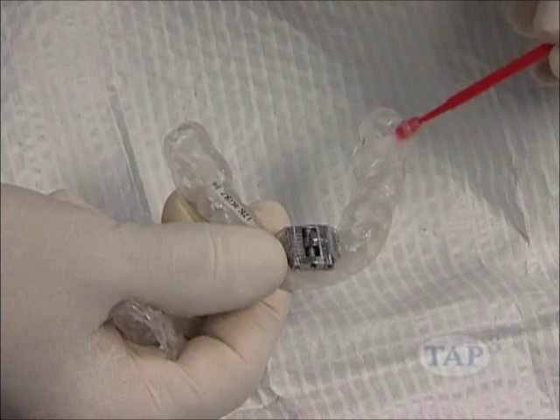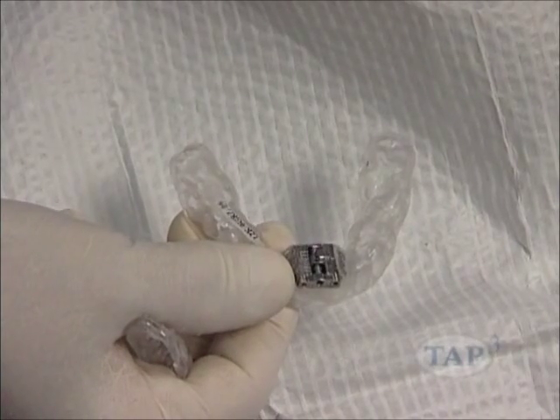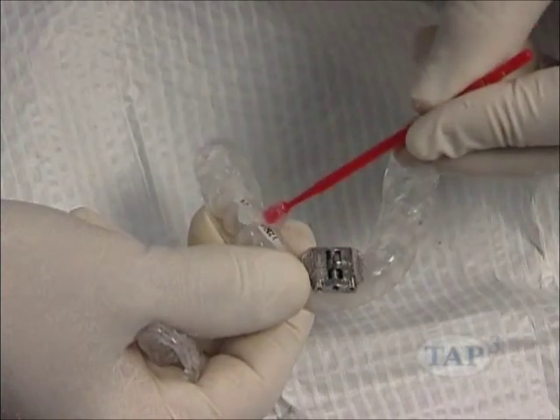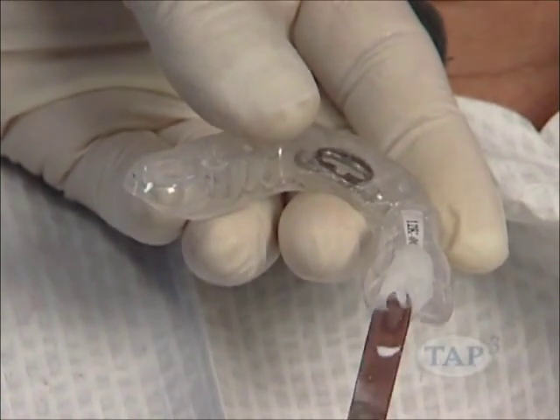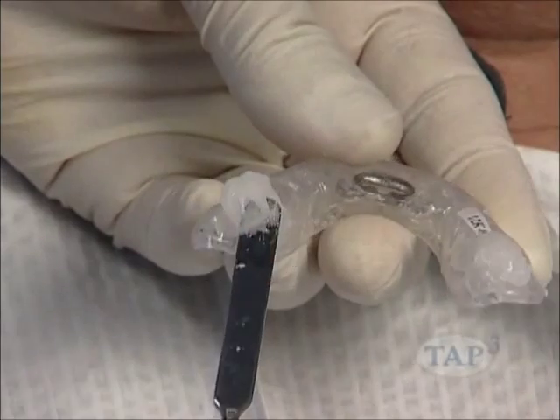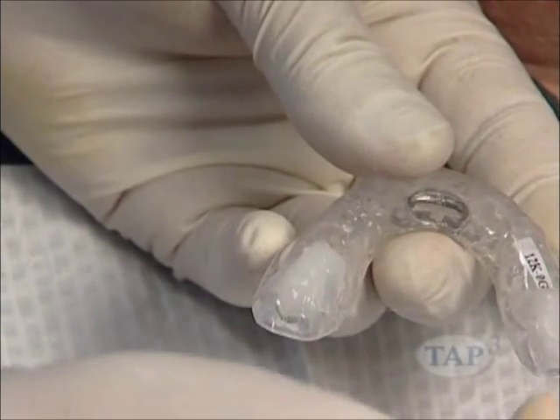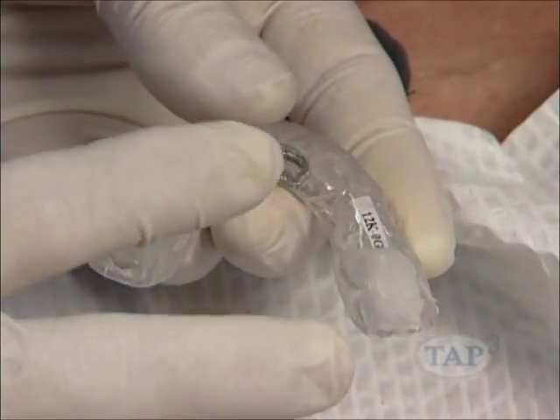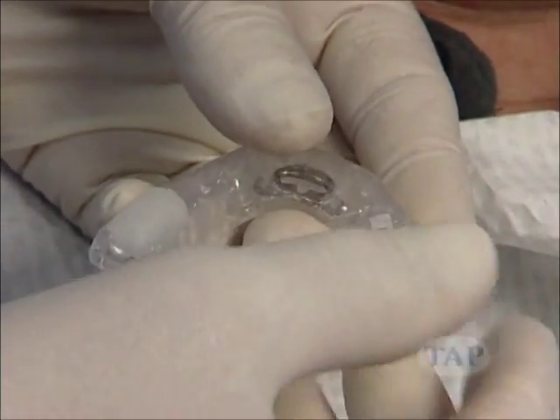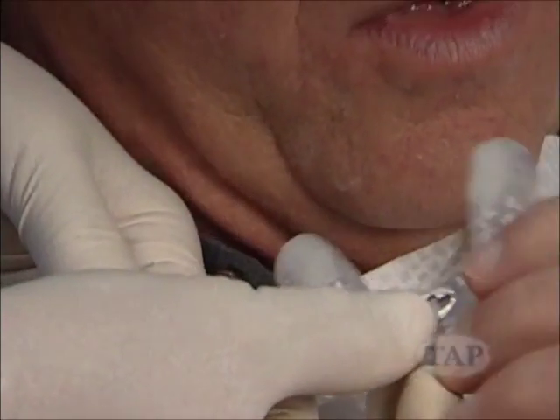First, lubricate the posterior of the upper tray with petroleum jelly. This will prevent the tray from sticking to the acrylic when adding acrylic posterior stops. Add cold cure acrylic to the molar area of the lower tray. Have the patient place the tray in their mouth and hook the trays together.